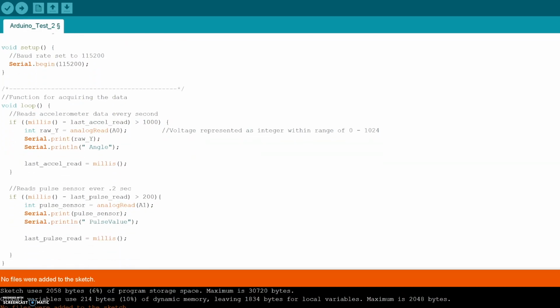From here, we have a continuous loop which handles the sampling frequency for both sensors. The two logic statements are used simultaneously to check the amount of time since the last acquisition. We sampled the accelerometer once per second and the pulse sensor every 200 milliseconds in this case scenario. Here we track the time in milliseconds using millis, which is an Arduino function.